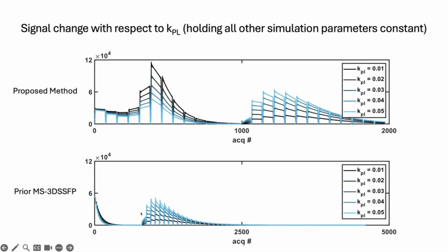And part of this is not exactly a fair comparison because the acquisition window for each one of these EPI or GRE-based acquisitions is much longer than what we would get from a BSSFP-based one. We only have a 15 millisecond TR here, so it's not a complete one-to-one comparison, but it does get you the general sense of the absolute signal magnitude difference that we are seeing by going from a GRE to a BSSFP-based acquisition.